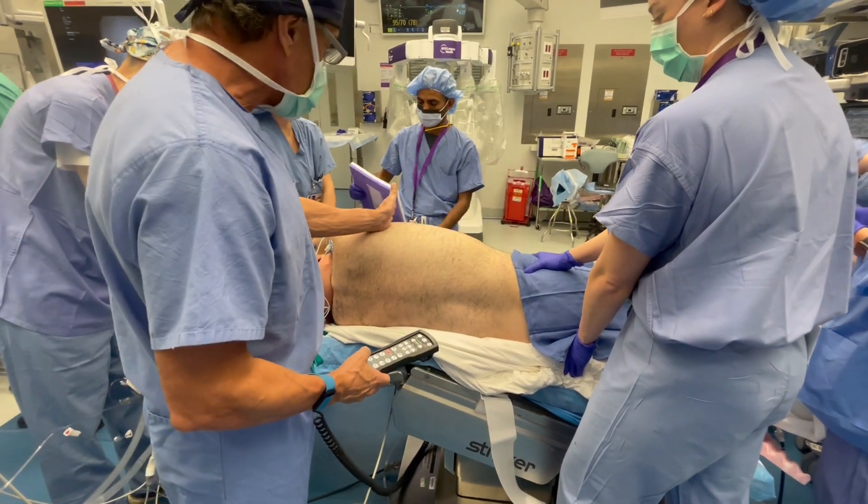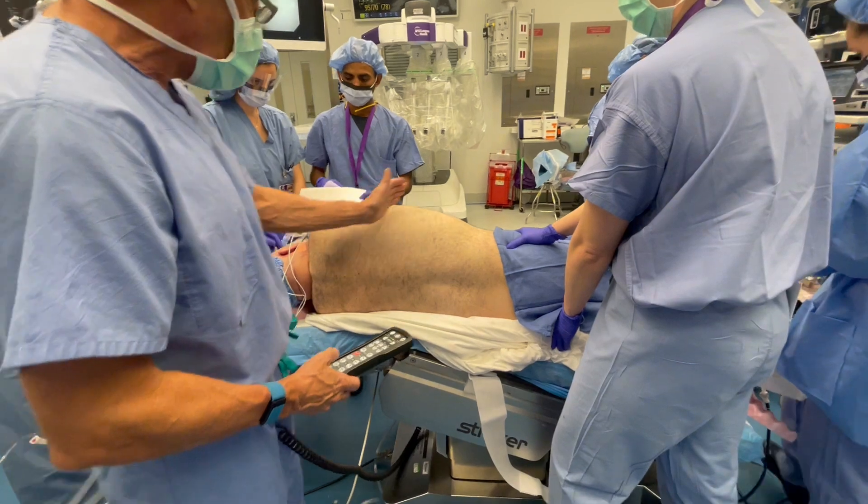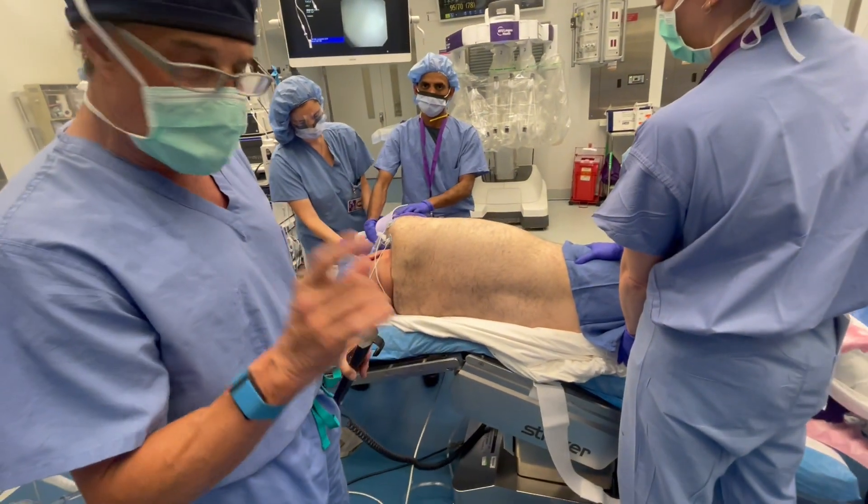You don't need a beanbag, that's ridiculous. You don't need an axillary roll, that's ludicrous. You want to put a roll here to help break them again, but this patient doesn't need it. That's it. Turn it off. Up.